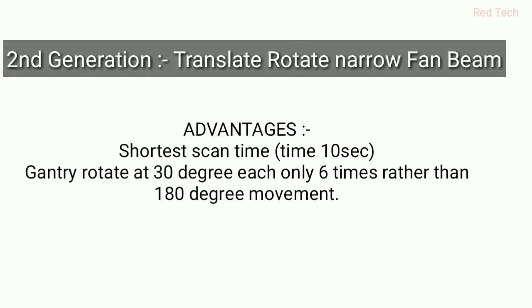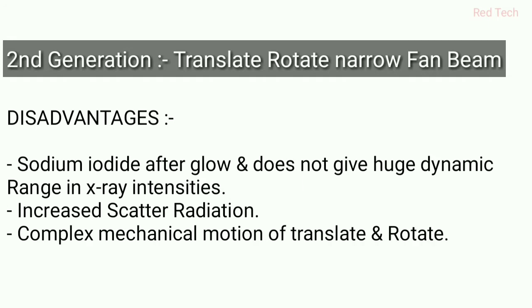Because of using a high number of detectors, this system was a modification of the first generation, which can rotate only 30 degrees because of having a fan beam also.